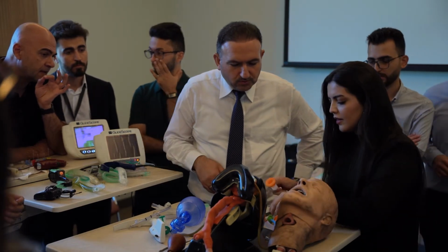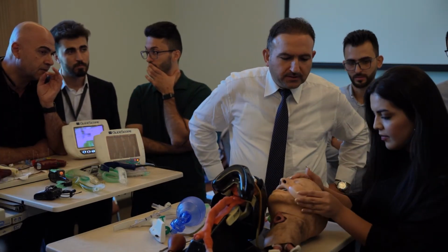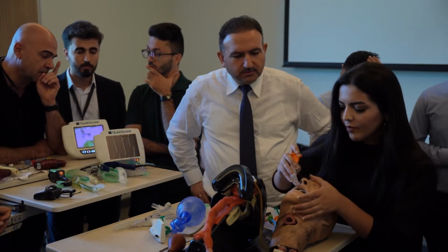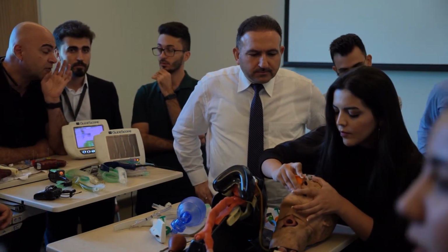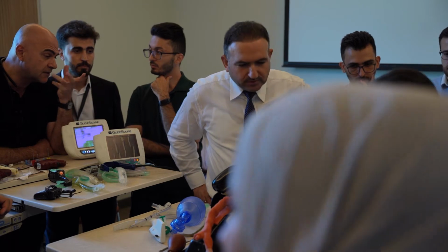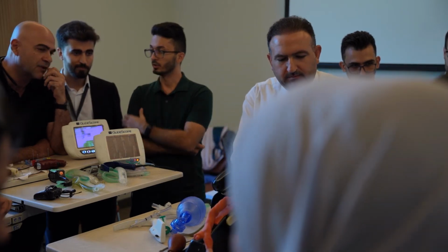Vomit, blood, you need to remove them and then put the oropharyngeal airway. If you cannot put it, put a nasopharyngeal airway, if available. If you cannot put it, just ask one of your colleagues to hold the jaw thrust and ventilate with the Ambu bag.